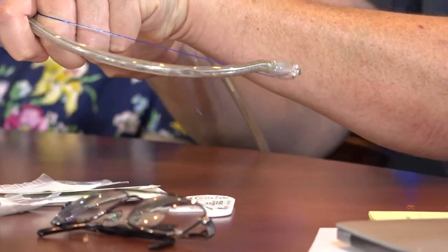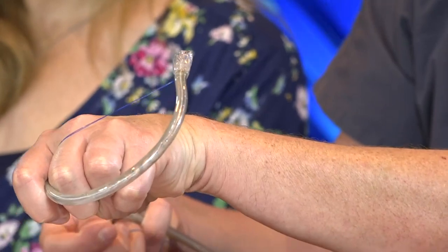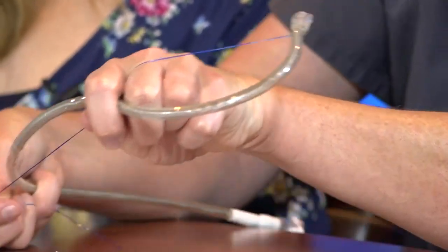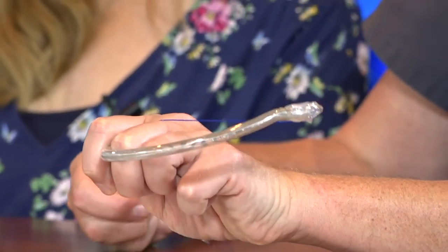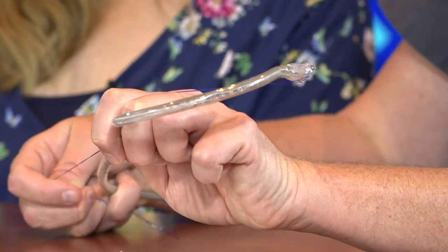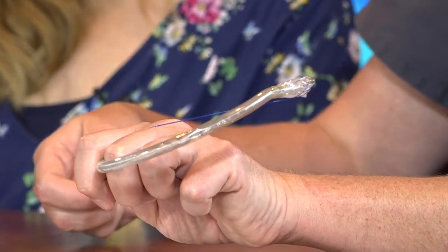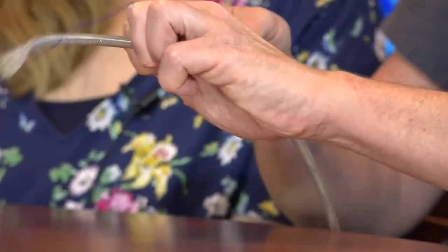Now it looks like you want to go that way, but you really kind of want to go more anterior, because that's really the direction that it goes. And while you're doing that, you can guide it and push it without pushing it out of the right ventricle or out of the right atrium. Some guys even go into the branches, the main pulmonary artery branches, when they do that. We have not had to do that yet, but that's also in there, and it's just this little simple technique where you don't ruin the pedals or anything.